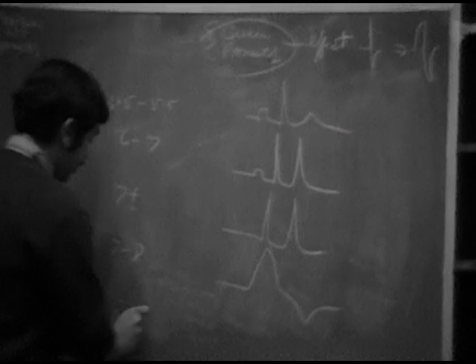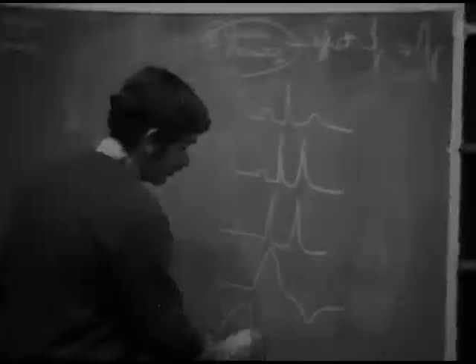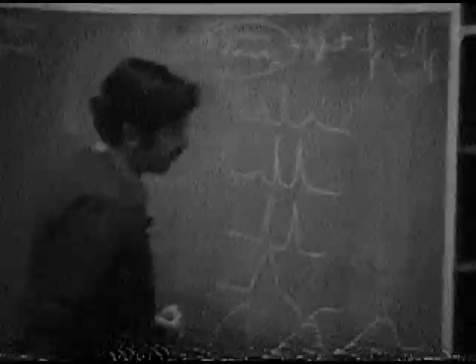Okay, now the important things to recognize, well, let me just finish this up. When you get up around 9 to 10, eventually you wind up with agonal EKG or a sine wave. It just looks like a sine wave, and then they fibrillate.